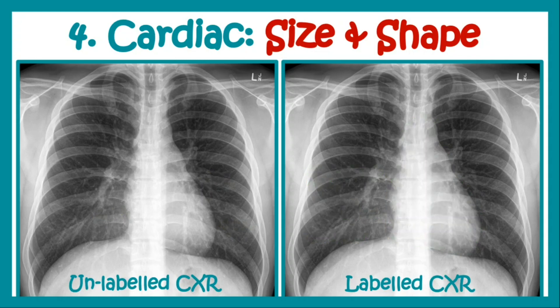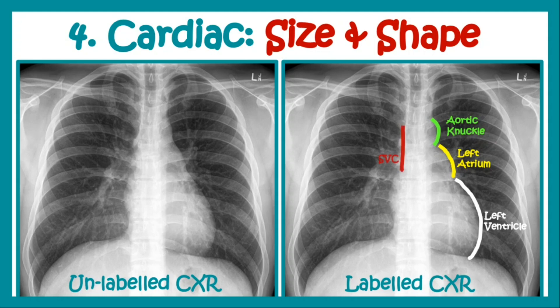Now let us come to the shape of the heart. We can see the contour of the heart, and specific contours indicate certain parts. This part indicates the projection of the aorta, known as the aortic knuckle. The bulge just below it is the part of the left atrium, and then we see the left ventricle. On the right hand side we can see the shadow of the SVC, then the right atrium and the IVC. These are the structures visible on the contour of the heart.